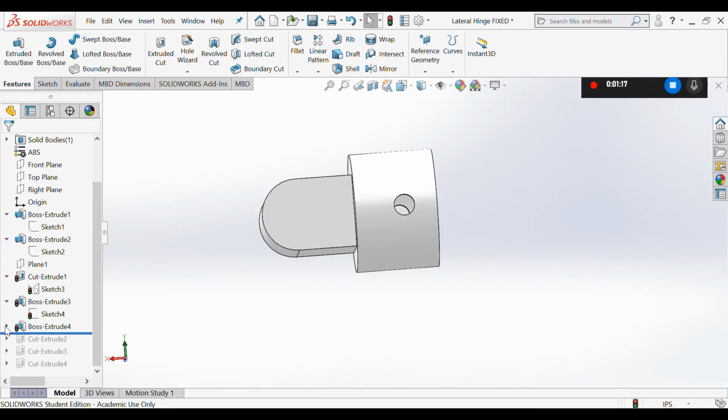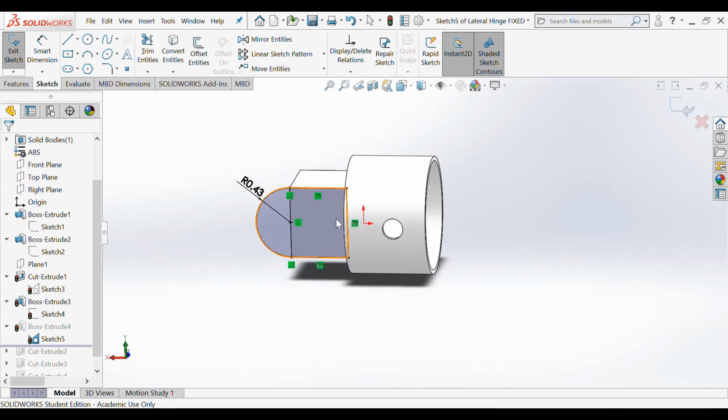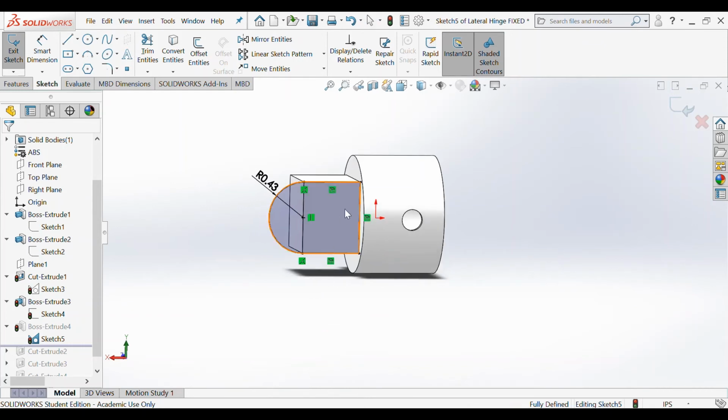Next, we're going to create another sketch. Now this is going to be on the plane of this surface right here, and we are going to go on ahead and use Convert Entities, which is up here. And we're going to convert all of the entities on this rectangular surface. Then we used a 3-point arc from this point to this point and made it a radius of 0.43 inches. Before extruding, we made sure to trim entities and trim off this piece right there to create an enclosed region.